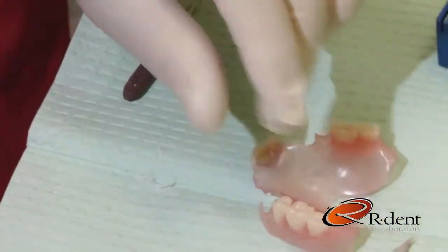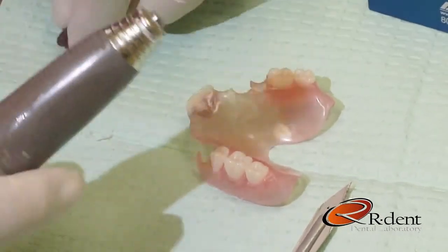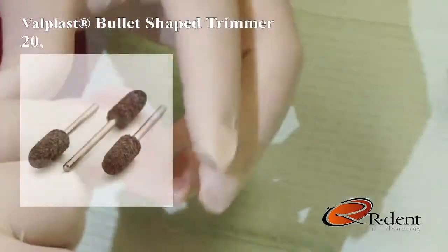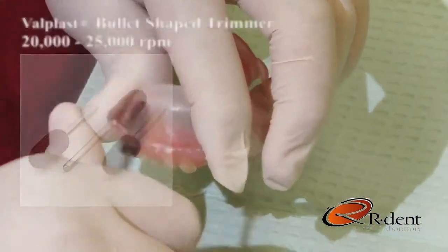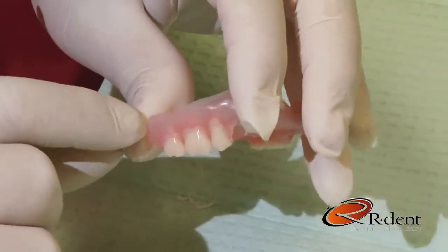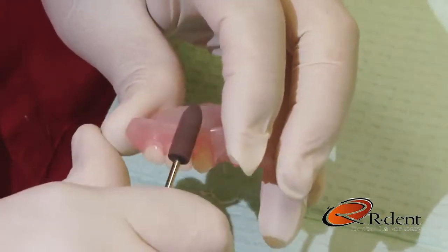If larger adjustments are needed and much more material needs to be removed, we use the Valplast bullet-shaped trimmer at approximately 20 to 25,000 RPMs. As you can see, the trimmer cuts very smooth and removes material very quickly.